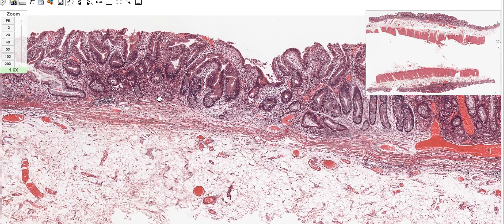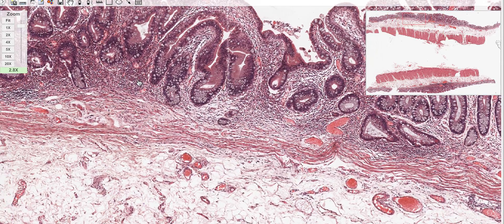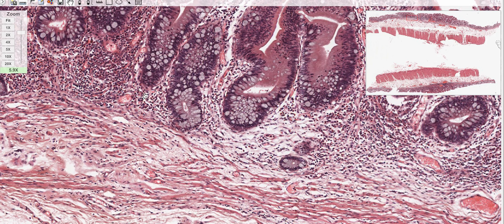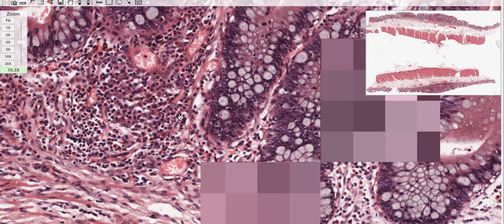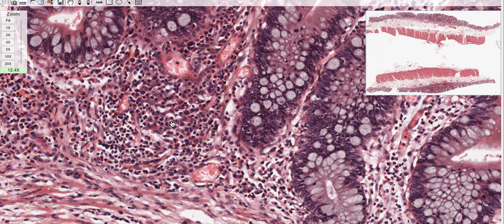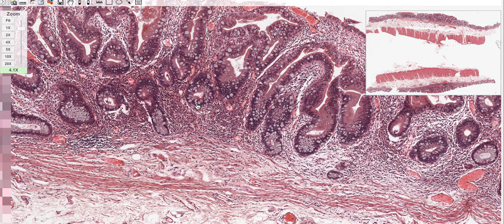Zooming into this basal area, you can see inflammatory cells here - a mixed inflammatory infiltrate with neutrophils, lymphocytes, and few plasma cells. Basal inflammation is very very specific for ulcerative colitis, and specifically basal plasmacytosis - that is a hallmark of ulcerative colitis.